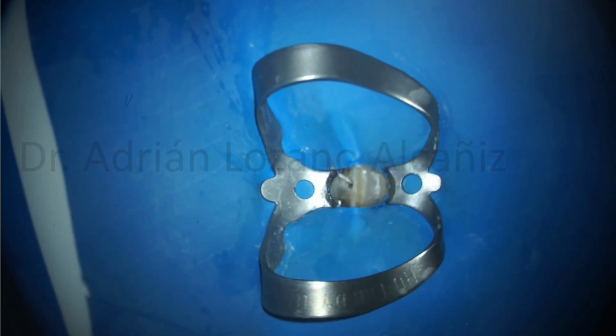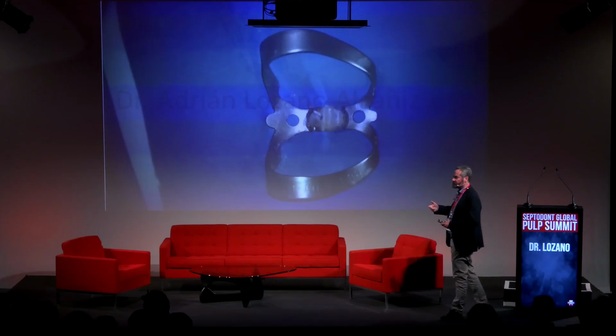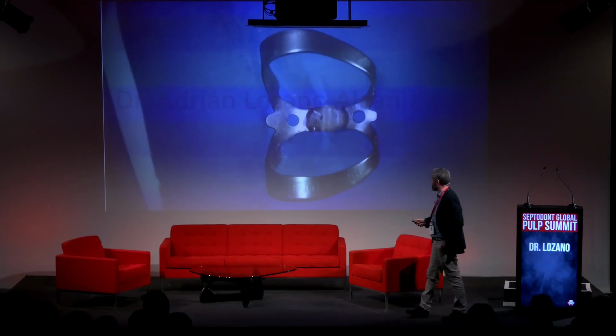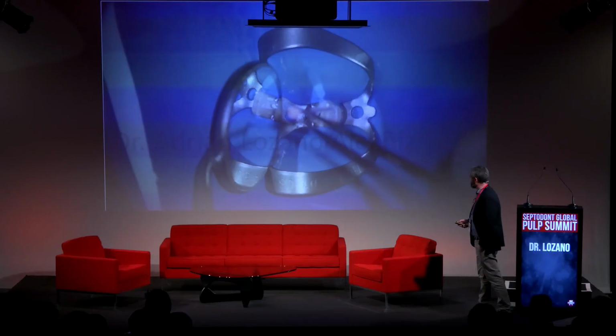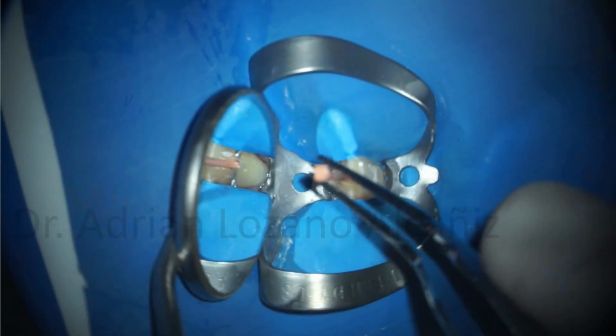When we put the tip in the coronal third, we press the syringe, but we have to move to the coronal part at the same time as we are pressing the syringe, because if not, the sealer is going to the apical part immediately. Then we go with the cones, with the 2 canals.